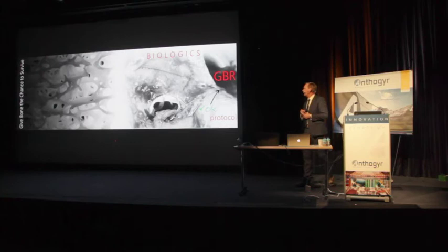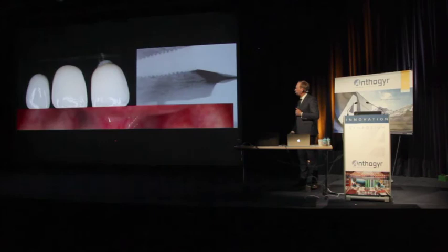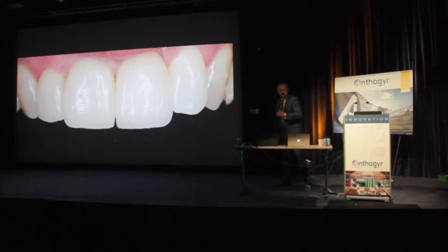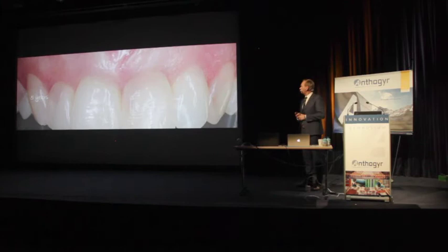Then, prosthetic part, the whole planning is important. Three restorations, three surgeries, 9 months later, we had gone from here to here. Metal-free restorations, hand-polished by the technician to get the texture right and natural light reflection. You can hardly tell that these are restorations. So, 5 year survival, stable pink interface, as you can see in this picture.